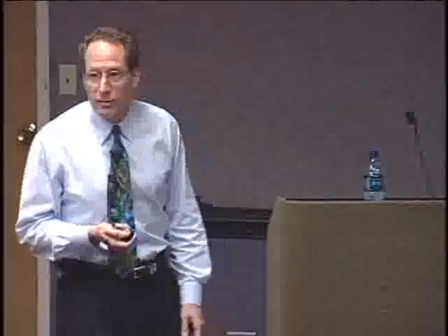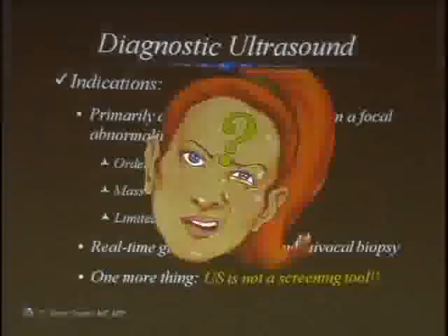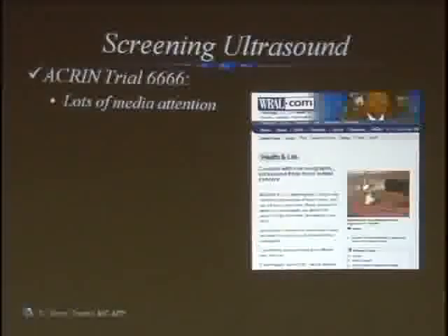One more thing. You'll notice that I started with diagnostic ultrasound. Okay? Here's another take-home thing. Ultrasound is not a screening tool in the breast. It is a diagnostic tool in the breast. Let's talk about that for just a minute, because I'm sure you've heard about screening ultrasound. Let's talk about screening ultrasound in the breast. This was big news. Big news. WRAL, Dr. Mask, all over it. Thank you very much. Confused everybody.